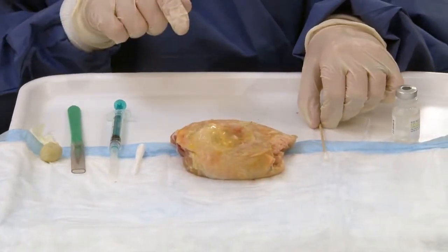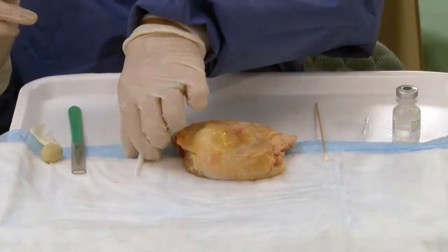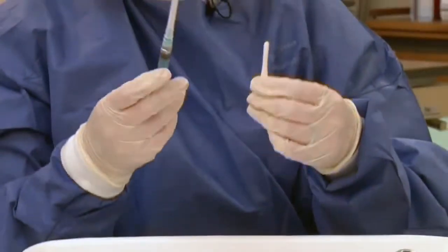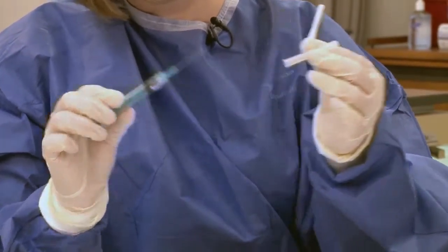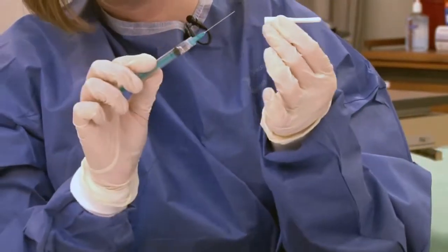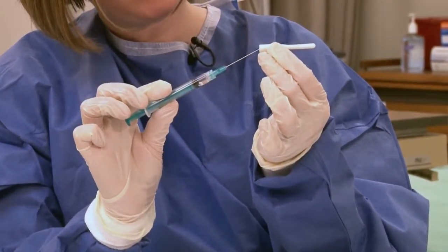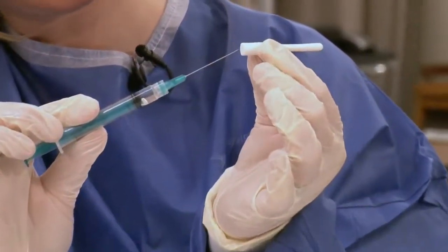As that is numbing the patient's vulva, I will make sure that the Word catheter will inflate appropriately. This is done with normal saline or with tap water. It doesn't matter. I have a needle placed right into the underside of the Word catheter. You can see where you place the needle.